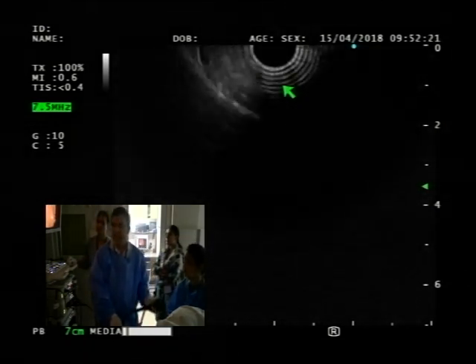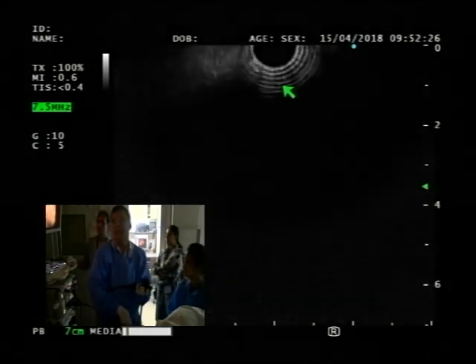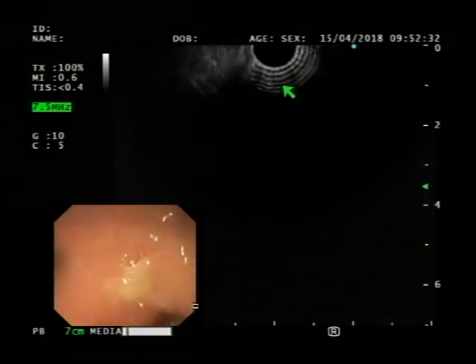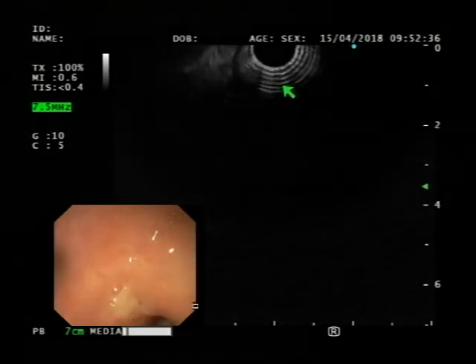So for this rectal cancer staging, as I mentioned, I think we don't have a radial scope here, right? It's not available right now. Our scope is actually broken, so that's why we don't have it. Otherwise, we did. So here, you see that area? I think that must be where the tumor was.